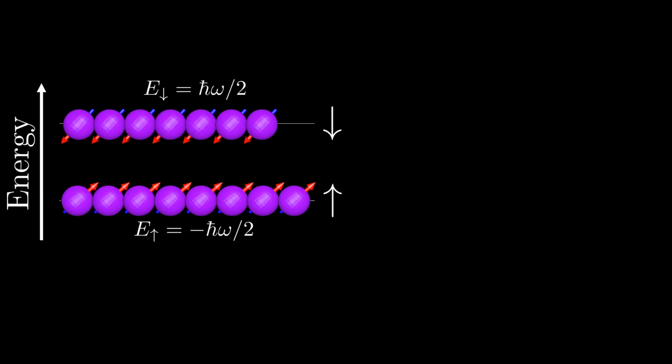So with this foundation, I'm going to abandon the energy state picture of nuclear magnetism and replace it with a single vector representing our Boltzmann equilibrium magnetization. Since we always align the z-axis of our frame of reference with the magnetic field B0, our Boltzmann magnetization vector is created along the same axis.